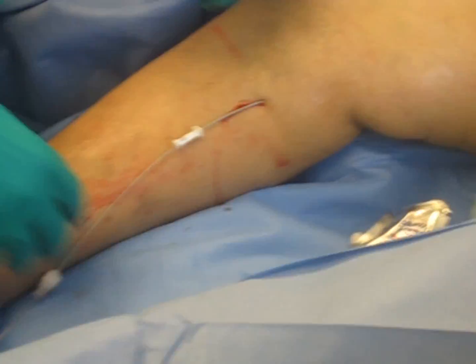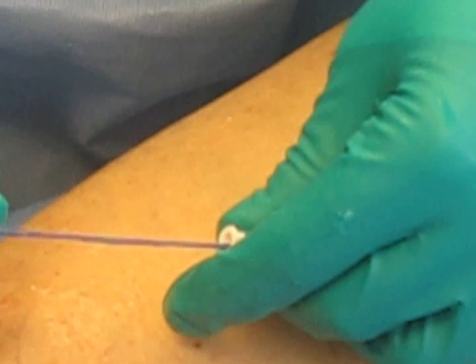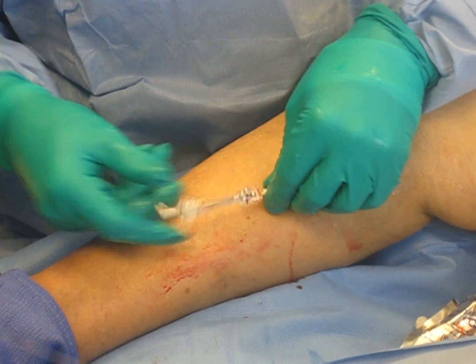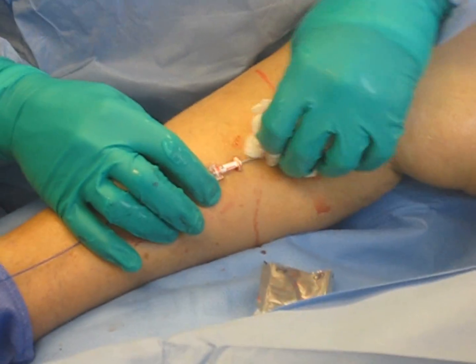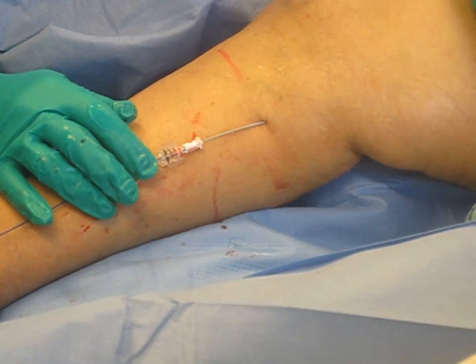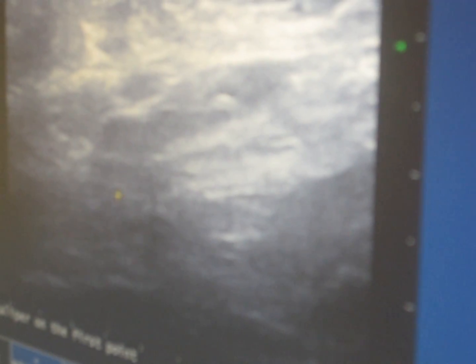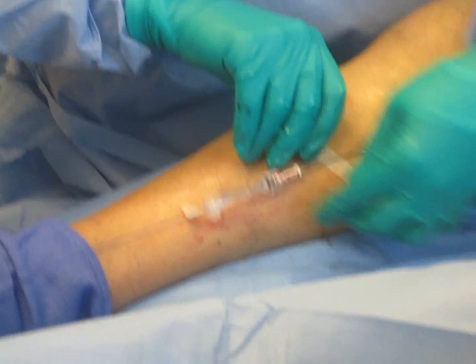We're going to insert the laser fiber on the inside of this catheter. She won't feel anything at all because it's all going on from the inside. These fibers are fantastic — they have an extra layer around the exterior, that's why they're blue, and that avoids the laser energy being dispersed outwards. It keeps it inside the fiber and guides it up to the end. This part of the procedure consists of placing our laser fiber exactly where we want it — right behind that valve. We are on this patient about two centimeters back; that valve will serve as a shield to keep the heat from going forward.